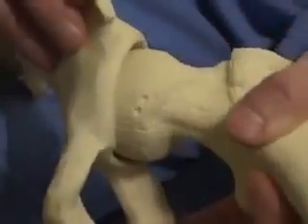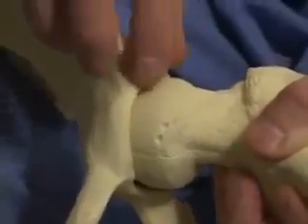By putting the scope outside of the central compartment and into the peripheral compartment, we can identify that spur, whether it's on the femoral neck or the acetabulum, and use a burr type device to remove it and therefore eliminate that impinging process. Hip arthroscopy has gained a greater role and importance in treating these types of conditions that I've mentioned. The surgical technique and the instruments have greatly improved over the last few years to make this process more reproducible and safe for our patients. The results of this procedure are generally very favorable for the conditions that I've talked about here today.